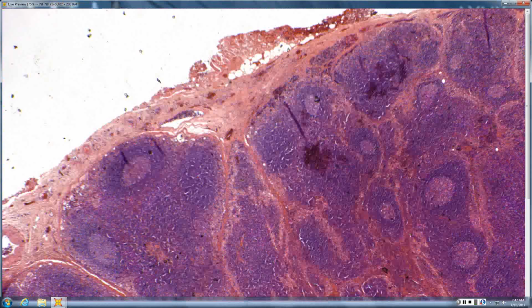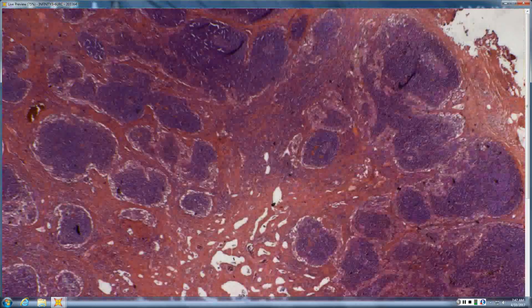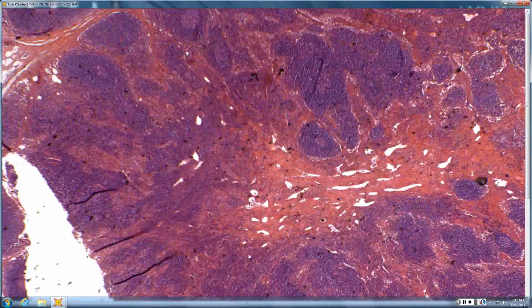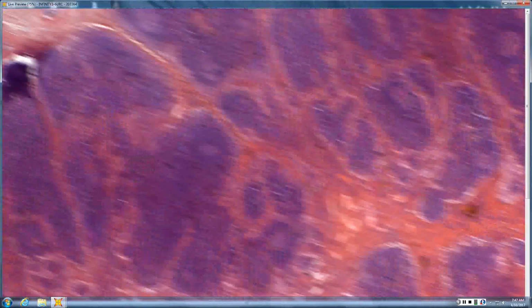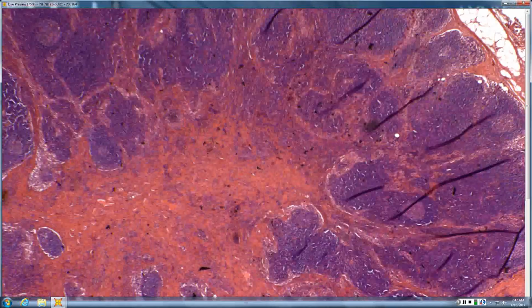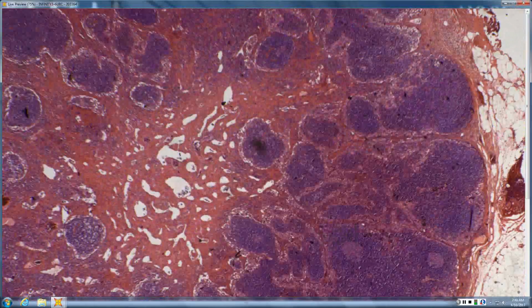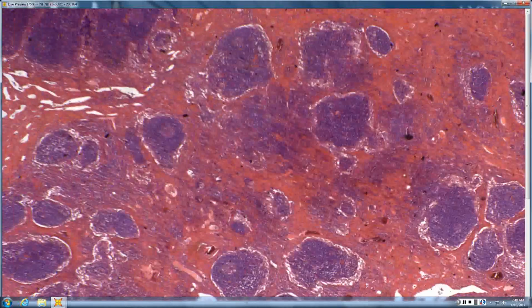So this looks like a tonsil or a lymph node, except that it's neither. It does sort of look like a node. You have lots of reactive germinal centers, and if you look higher, there are lots of EOs in there too. Just a rip-roaring ALH, or Kimura if it was in a lymph node.